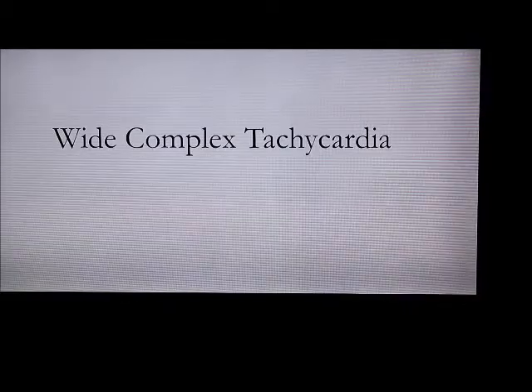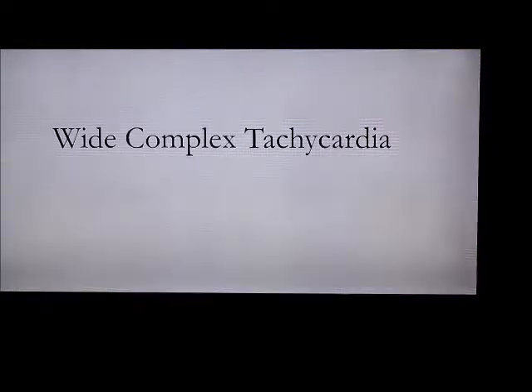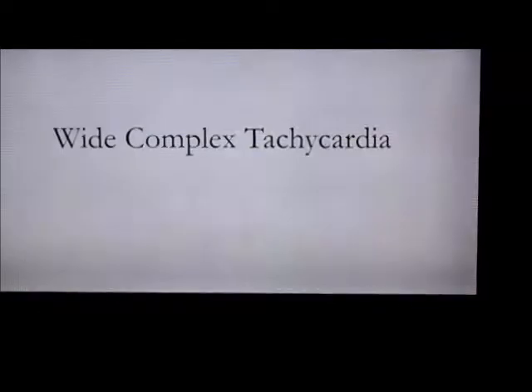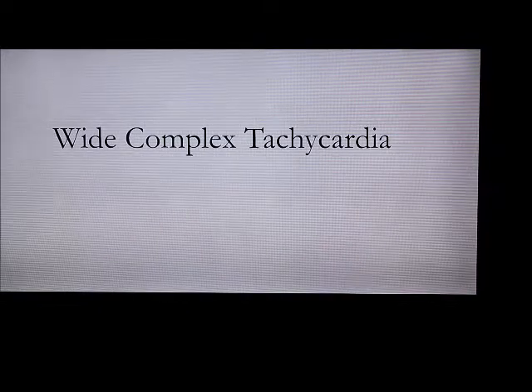Doctor, sorry, typical or atypical, how can we differentiate between them on the ECG? By the RP interval. So a short RP interval is typical. A long RP interval is atypical. No, there's no other way.